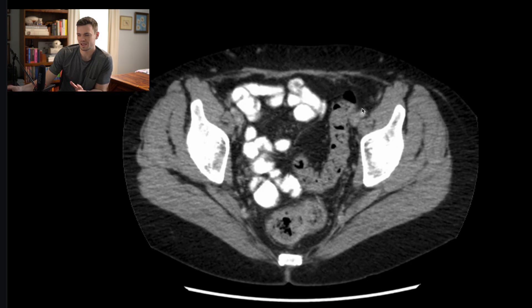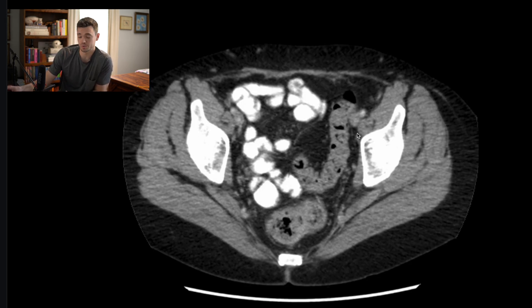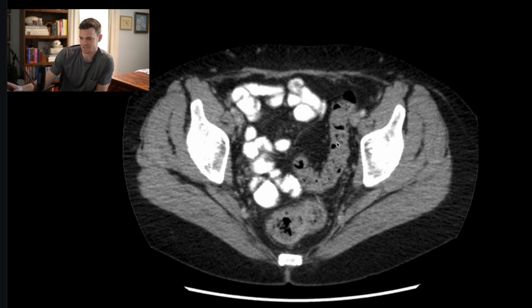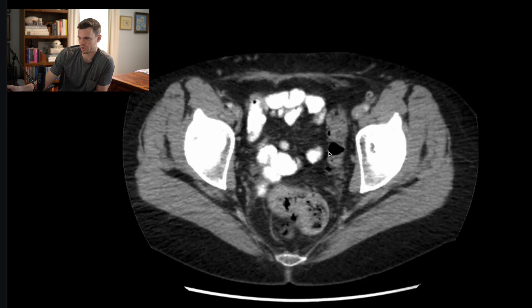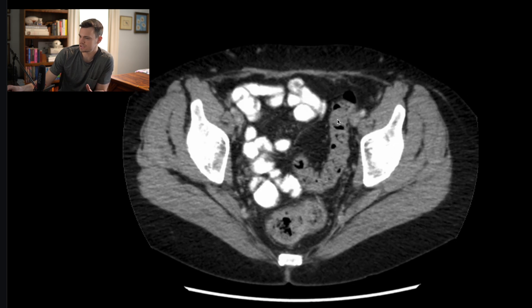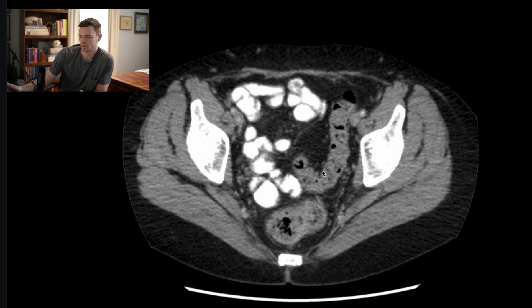Before we go on to a case of diverticulitis, I want to contrast what I just showed you — diverticulosis — to a normal-looking colon that doesn't have all these little outpouchings. Look at the colonic wall here; this is the sigmoid colon. Notice just the smooth margin of the colonic wall. This is a case of a normal sigmoid colon, one without diverticulosis.